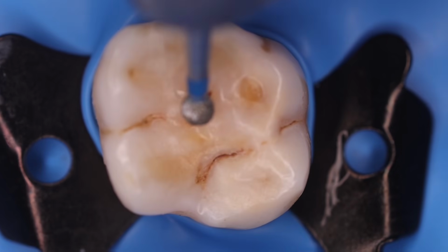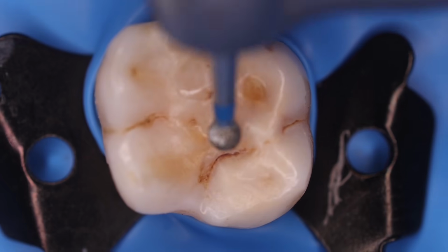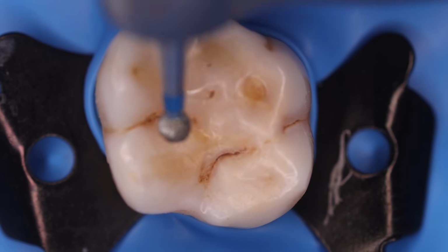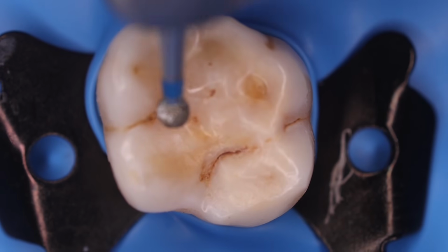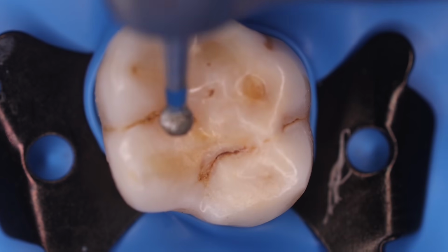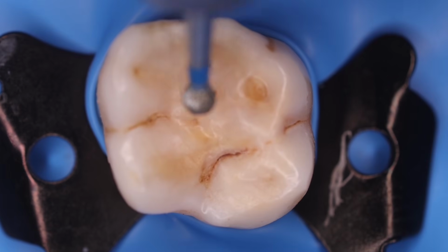So we would be approaching from the center towards the mesial aspect, and then the middle aspect, where we could find the palatal canal, and on the mesial aspect of the distobuccal cusp we would be able to find the distobuccal canal. So let us proceed at the center.